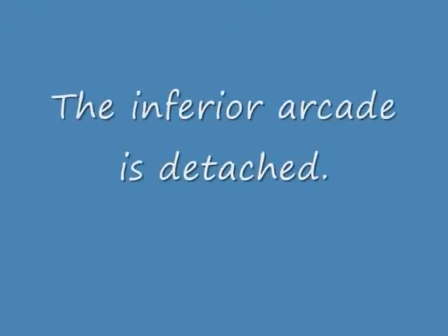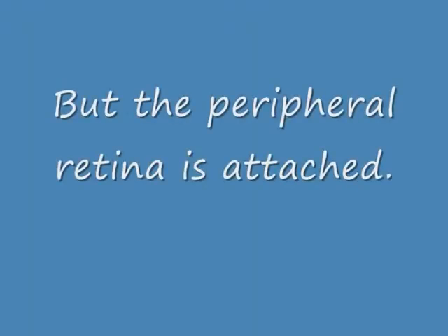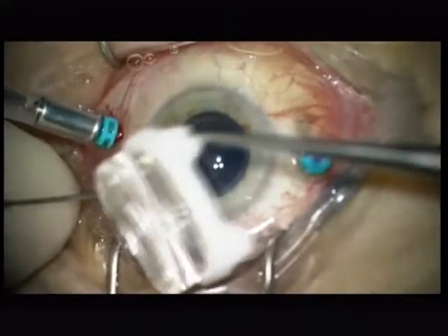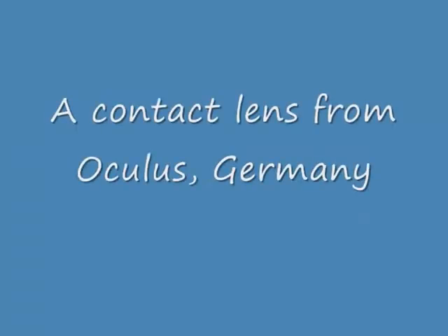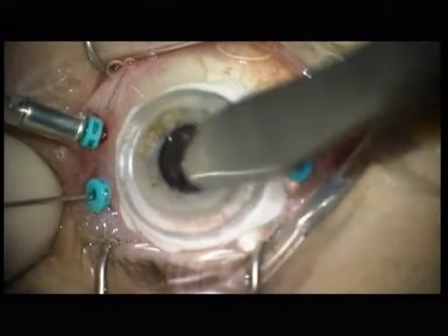I stay in the posterior hyaloid with membrane duale because I have to do a PVD. But let's first examine the peripheral retina, which is attached. I'm happy — I see no peripheral detachment. But how come this huge central detachment extending over the arcade?